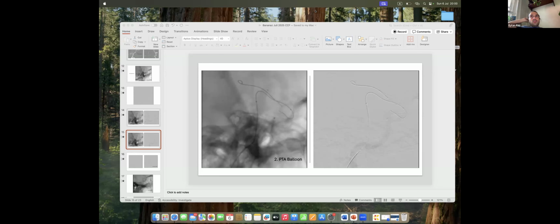Now, Dodi, these 30 cases were not all direct fistulas, right? You were talking about also aneurysms or other conditions. Yeah, dissection, these are the intracranial cases. So aneurysms, more or less giant, carotid ophthalmic, and also one dissection of the middle cerebral artery.